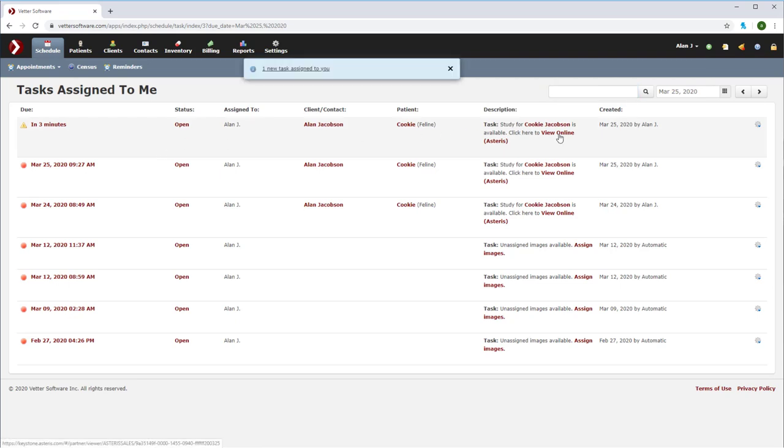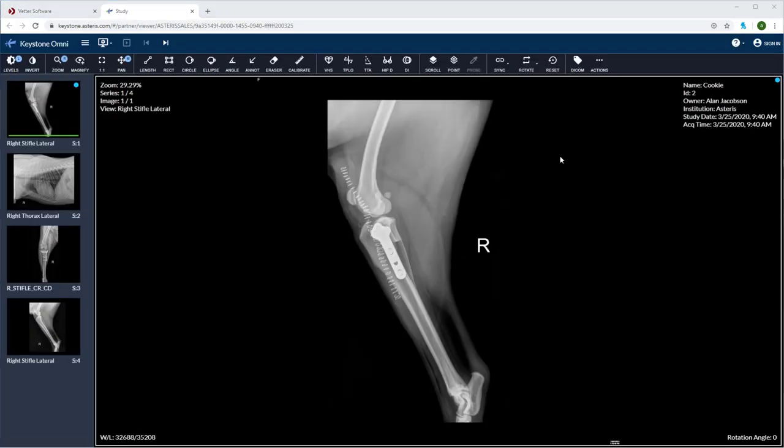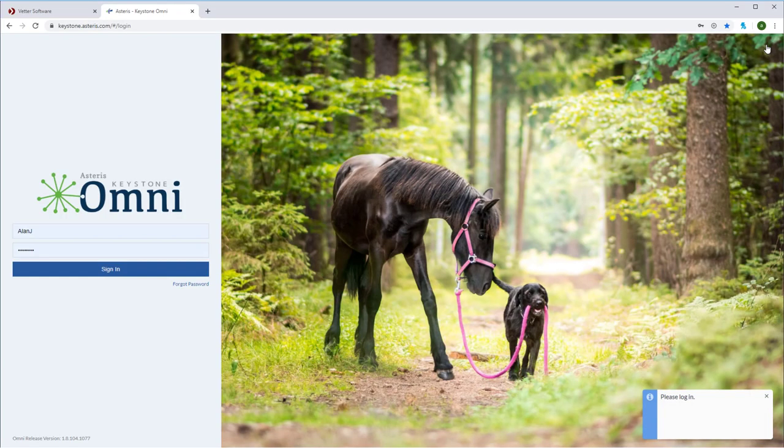Now we can click on the view online Asteris to pull up the images directly. Now we can view our images within the keystone omni platform. All of the tools and measurements will be at your disposal. Be sure to log in if you'd like to save any annotations.